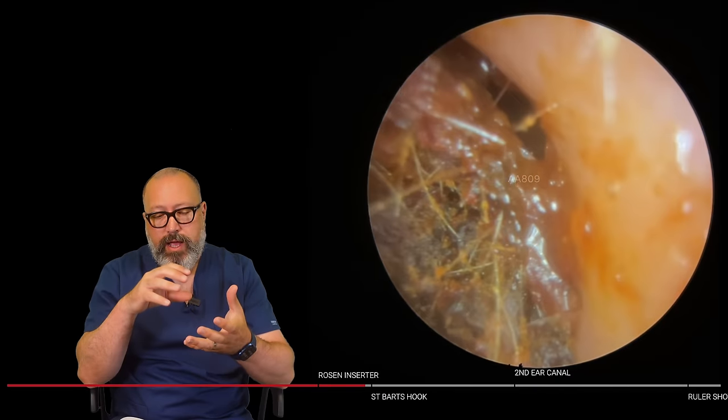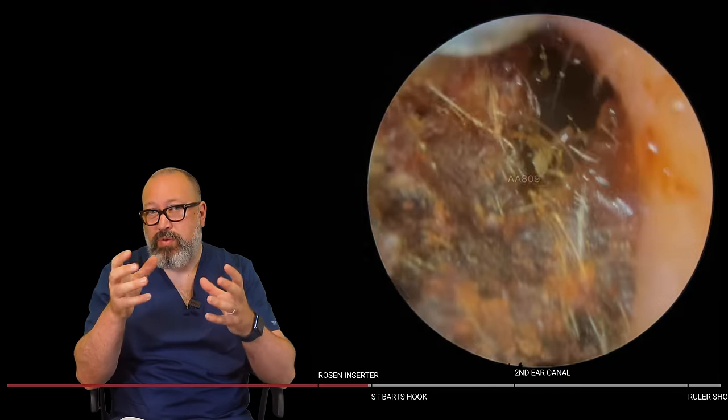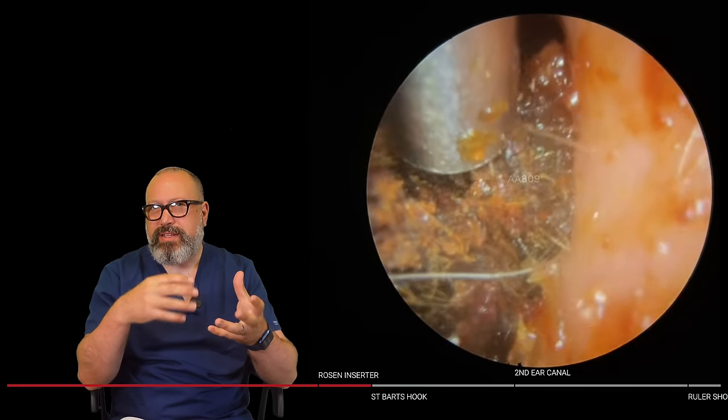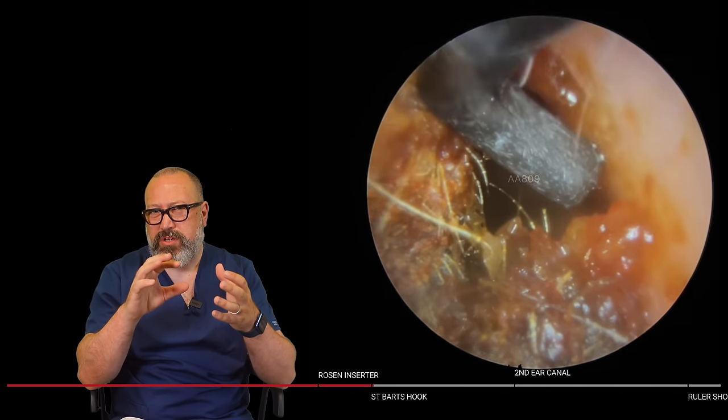So when you go in and you use some curettage, a lot of the time little bits will break away off the main plug, and they all sort of collect at the bottom of the ear canal. So once I've used a tool, I'll tend to go in and use the suction just to tidy up.